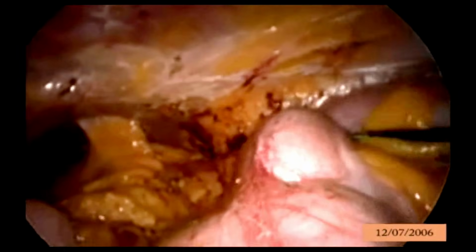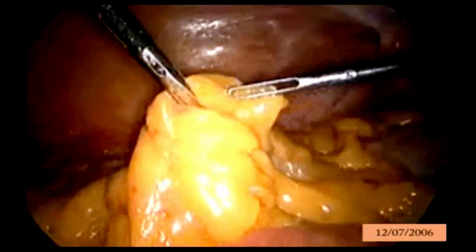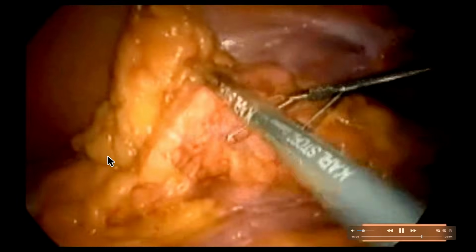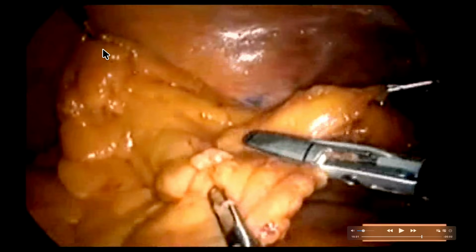After that, you have to decide what you have to remove and what you have to keep. You can see throughout the surgery till now there was not a single drop of blood. So if you see here, this right side is sigmoid, left side is descending colon, and this ligation will split this mesentery because the right side has to be removed, left side has to be kept.